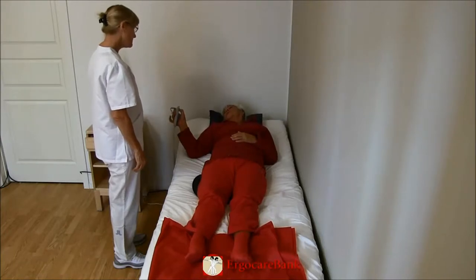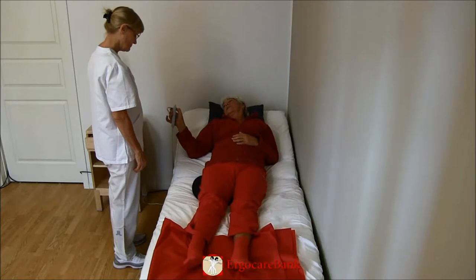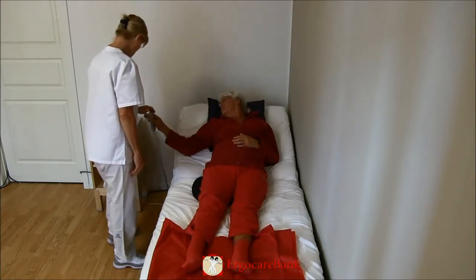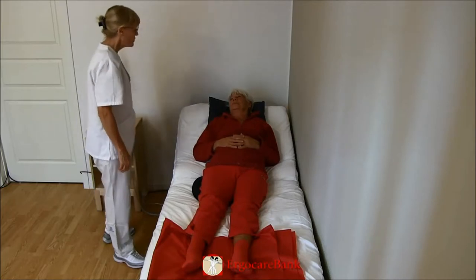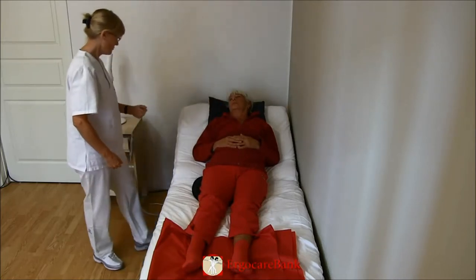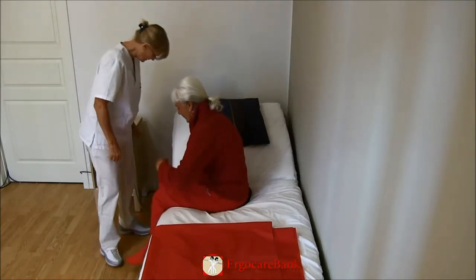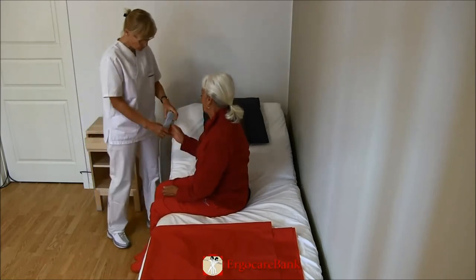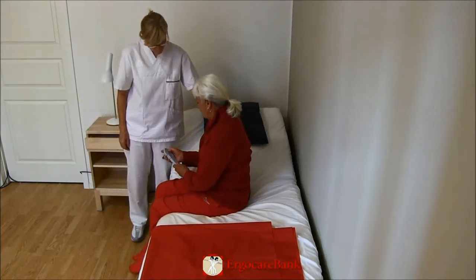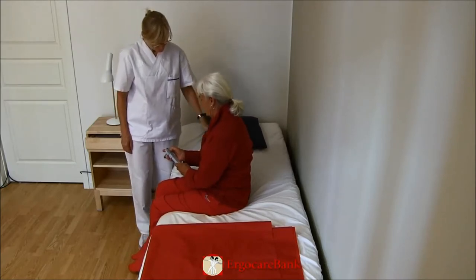Celia raises the bed, and when she's ready to get up, the staff member tells her to grab the mattress with your right hand, stretch your left arm across your body, and swing your legs over the edge of the bed. When Celia feels she's sitting steadily, she puts the bed back to normal.